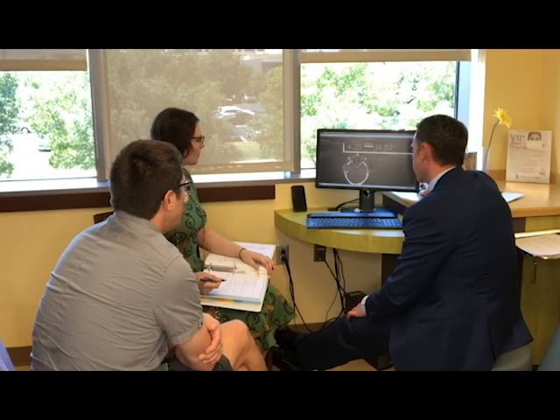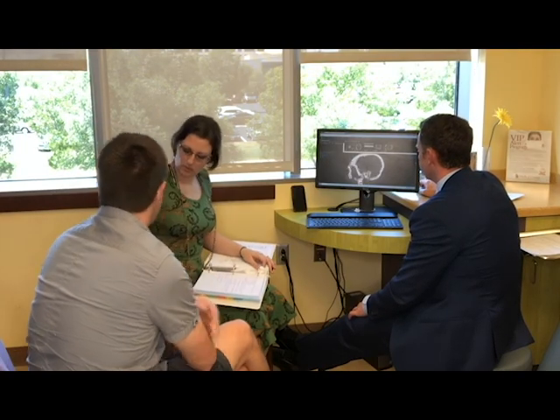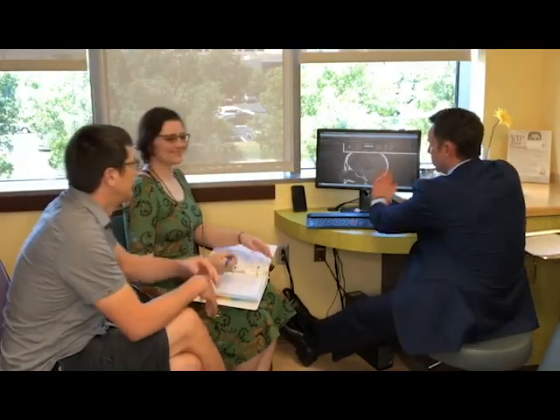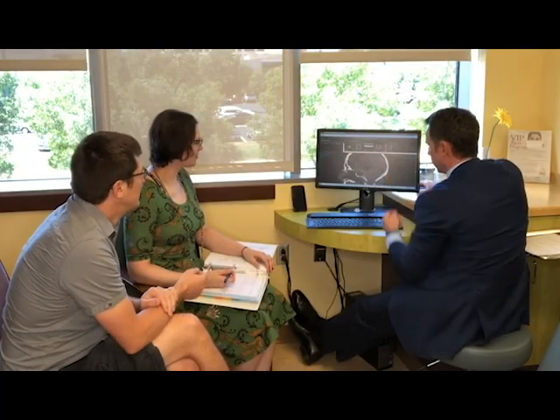This also, and this is you looking out. Actually, let's start this. This is you looking. There you go. Perfect. Thank you. This is you looking sideways. Okay. So nose here, your mouth is down here, forehead, top of the head, back of the head.